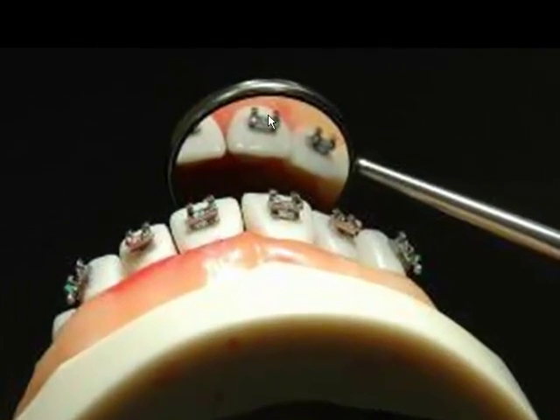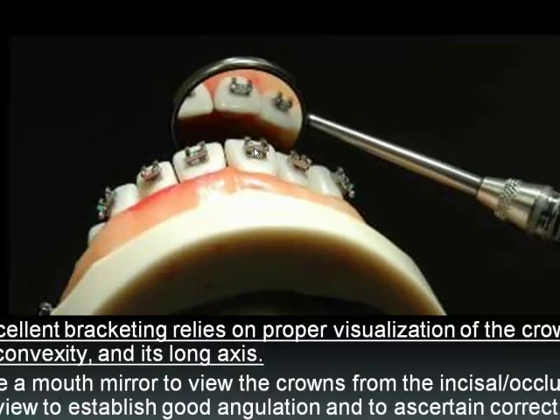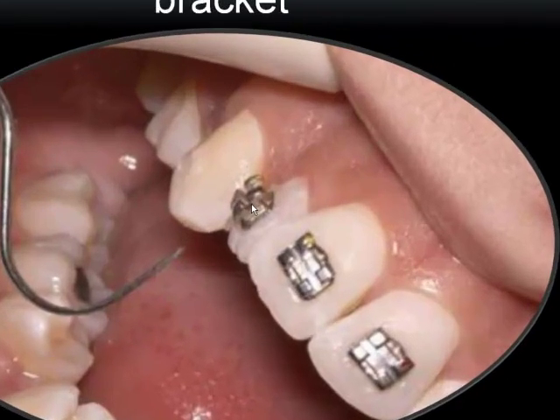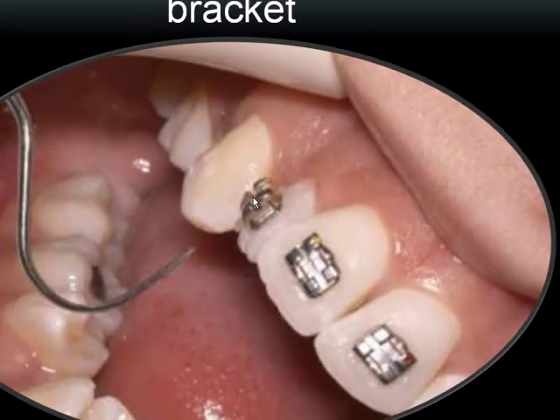Use the mirror to check the long axis of the tooth. Always try to set your bracket in the proper position regarding the long axis of the tooth. Obviously, when you press the bracket onto the tooth you will have some excess composite, and then you have to clean it. It doesn't change much orthodontically, but it helps the patient with dental hygiene and makes the orthodontic appliance look much nicer and neater.